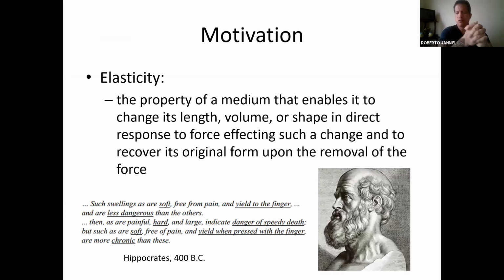There's a lot to say about elastography. Actually, if one were to talk about these techniques in actual depth, we would probably have to spend at least a month or something talking about this. But we're going to give a quick overview, because it's a relevant piece of technology that you can find in most, if not all, high-end scanners nowadays, actually for quite some time. So I think it's really important that you get to know a little bit about this.